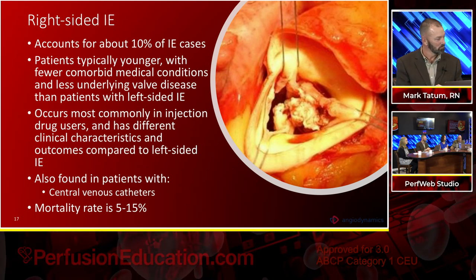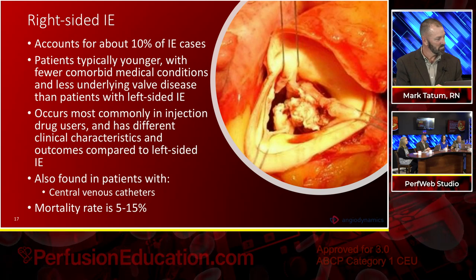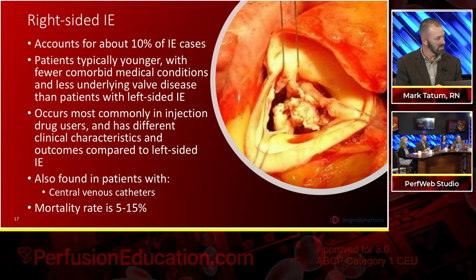But debulking it in itself, you're greatly reducing the risk of embolization. Exactly. So on its own merit, it would improve the potential survival of your patient just by this alone, from embolization. That's what we're looking for. And all the other bad things you talked about with pulmonary infection, having an embolus there and then getting a roaring infection in your lung. Yes, exactly.